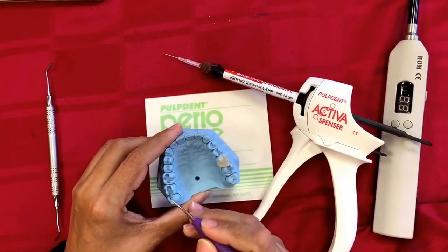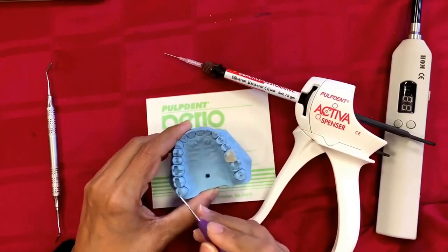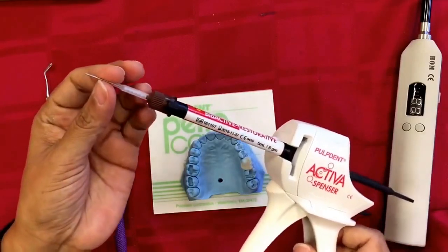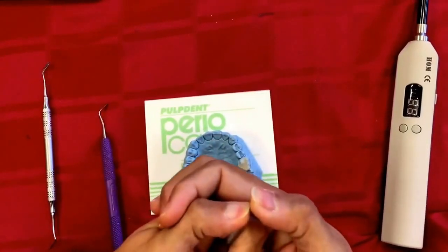Etch for 10 seconds, wash it off, and leave the tooth surface slightly moist. Here's the Activa syringe with Spencer tips — these tips are so easy and bendable in any direction.